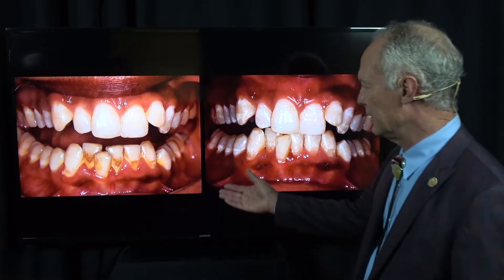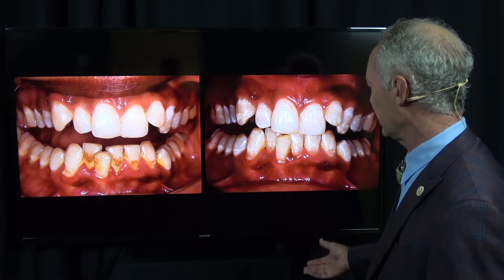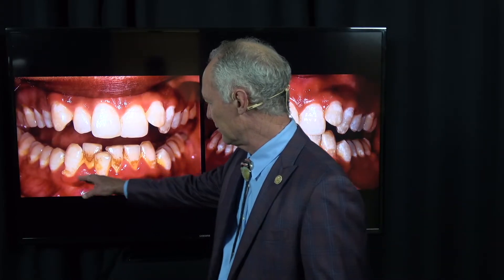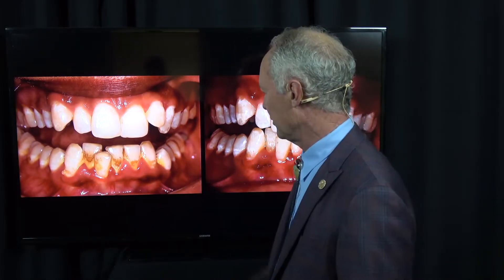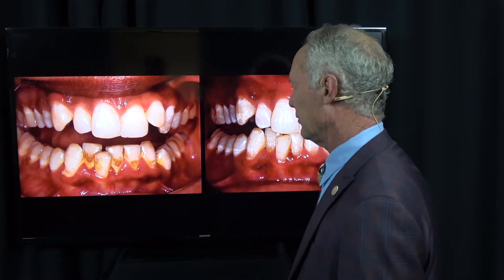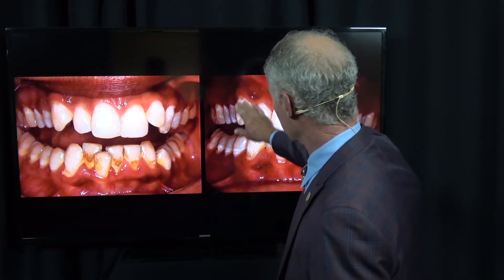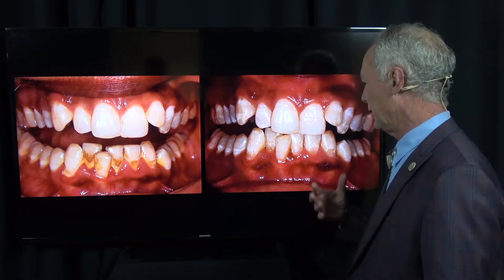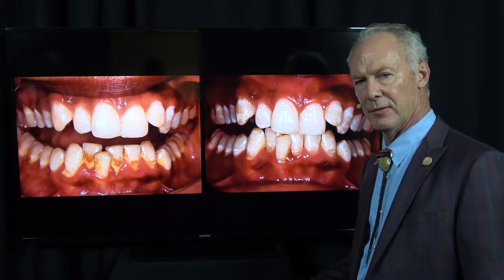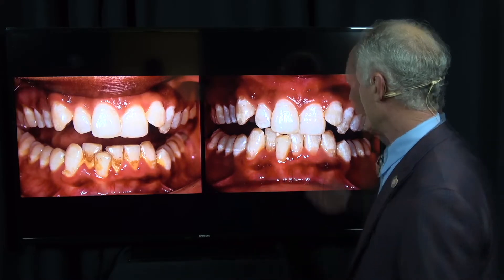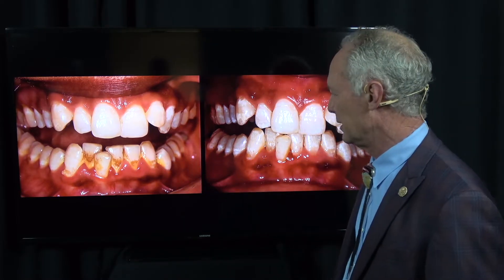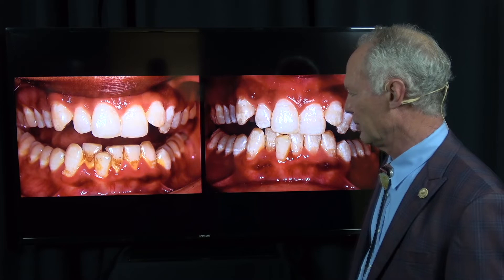Hello, let's talk about deep cleaning, scaling, and root planing. You'll notice this patient has got a lot of calculus and plaque and stain buildup on the teeth. They also have what's called mottled enamel, where the enamel is white and brown, and this can be caused from minerals in the water the patient is drinking when the teeth are forming, or could be caused by medication. This is a before and after of a deep cleaning, scaling, and root planing.